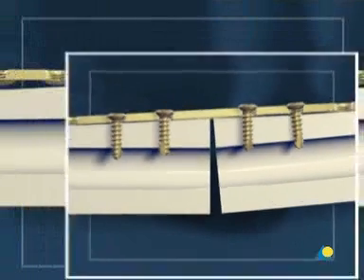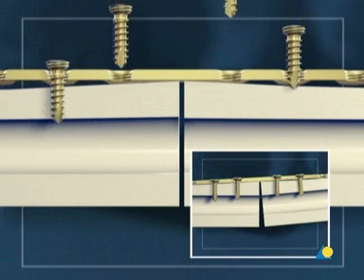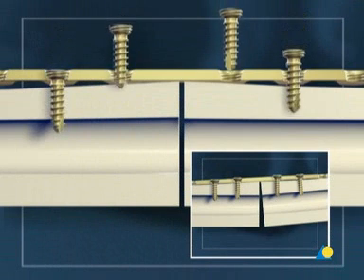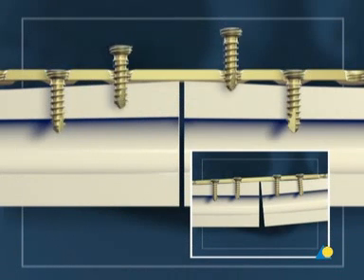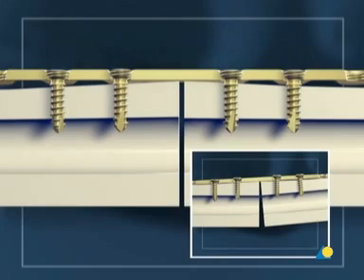However, if the plate is fixed with locking screws, reduction remains unchanged. Therefore, the plate does not have to be contoured as precisely as with conventional plating systems.